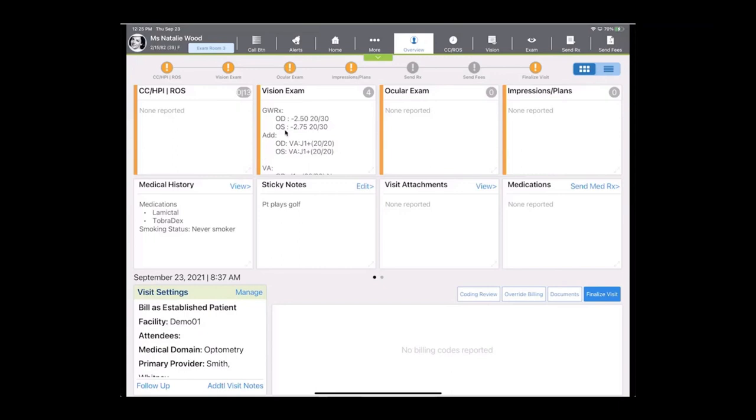The core vision exam, or most likely the pretest information plus your refraction and contact lens fit, and then the core ocular exam, all of your diagnosing procedures and plans. So once those three are completed, the impressions and plans will auto-populate for us, and billing and coding will auto-populate for us down at the bottom.